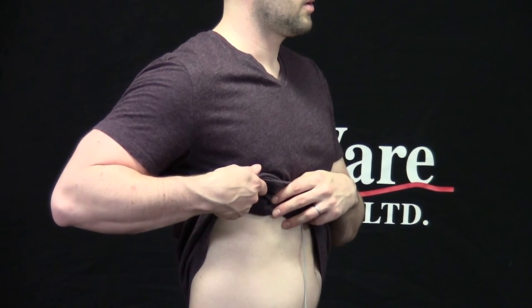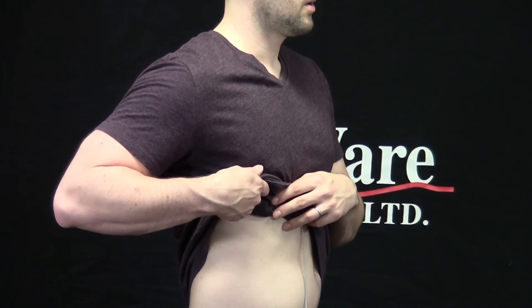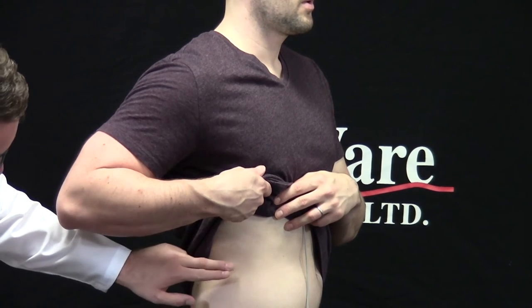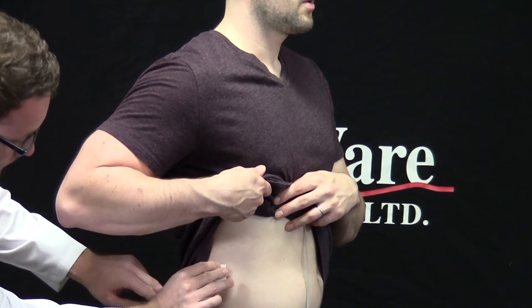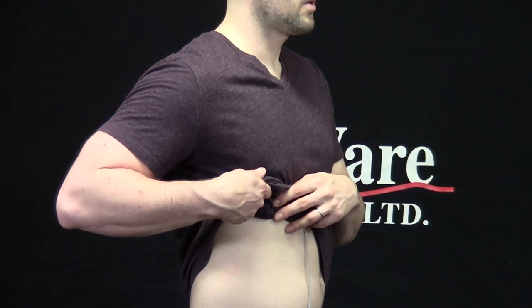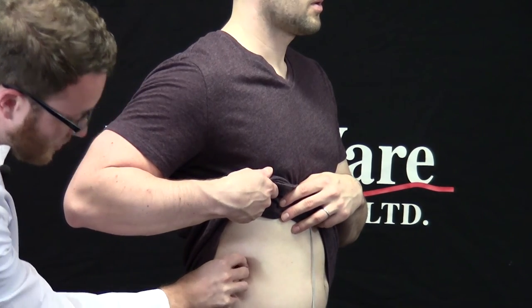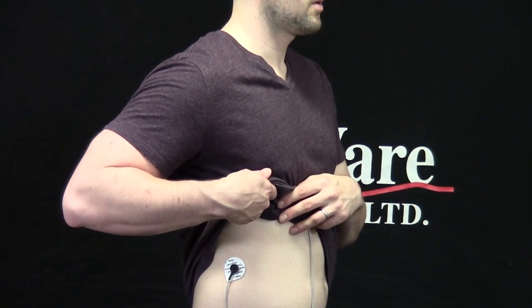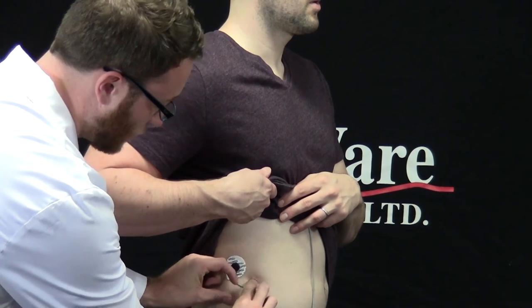Before the subject puts their shirt down, there is one last electrode to place. The ground electrode goes again on the bottom rib, but on the subject's right side. Again, I'm going to use my fingers to locate the bottom rib, clean the site, and take another electrode off the strip, but this time with the black lead wire attached, and place it on the site I've cleaned. Finally, I'm going to make a service loop away from the sensor.